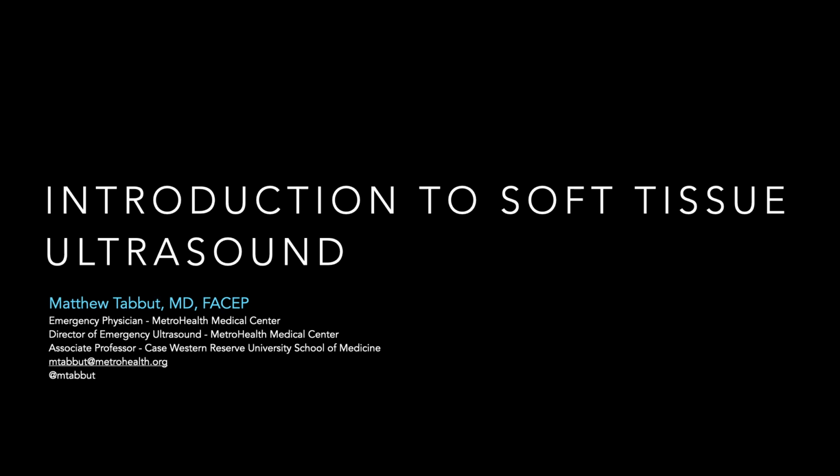But we're going to turn over to the slide deck and talk about some soft tissue ultrasound today. Let's talk a little bit about the context of a patient case. This is a 28-year-old female. And this is, like I typically do, a decently made up scenario, but it's based on a composite of patients that I've seen in my practice, and I think if you think back, some patients that you've seen in your practice as well. Let's imagine a 28-year-old female presenting to the ED with swelling, erythema, and pain to the mid-right forearm, right? And as you think about that, conjure up in your mind what that might look like.